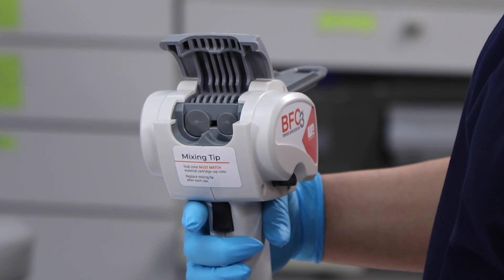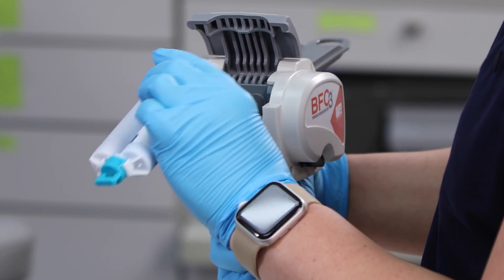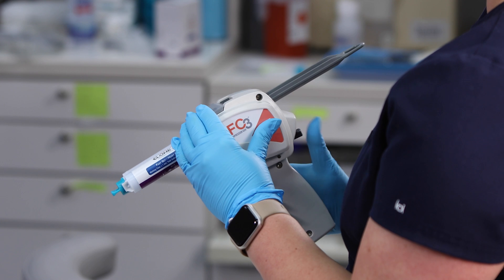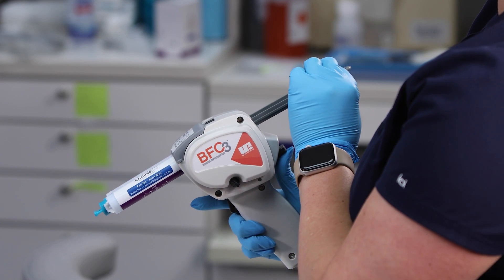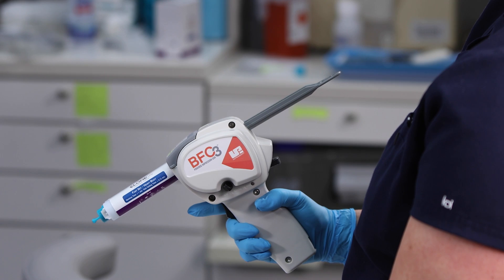To load a cartridge, open the cartridge door and insert a material cartridge notch-side down. Close the cartridge door completely. Press the plunger release lever again and slide the plunger forward until it contacts the cartridge. Release the lever.